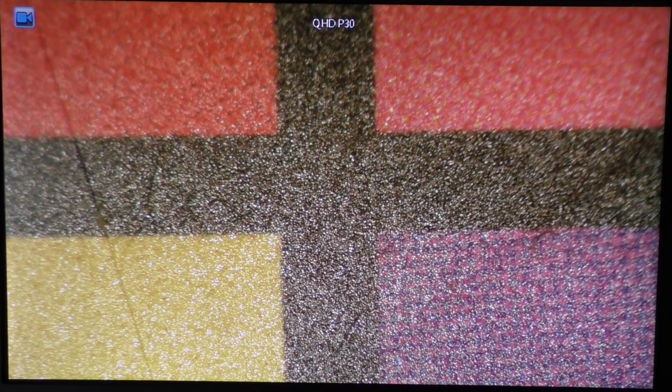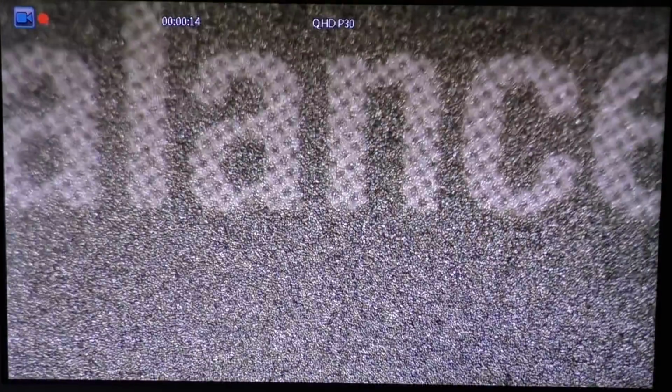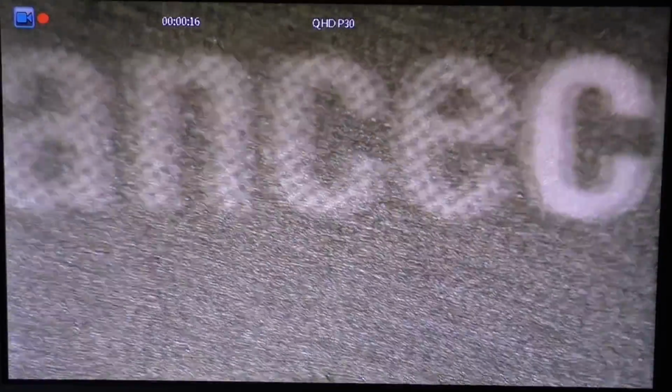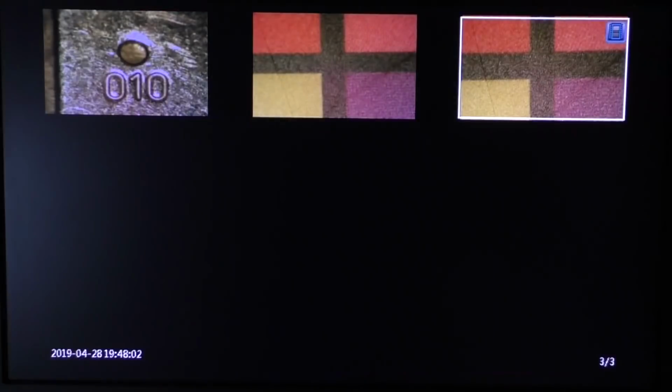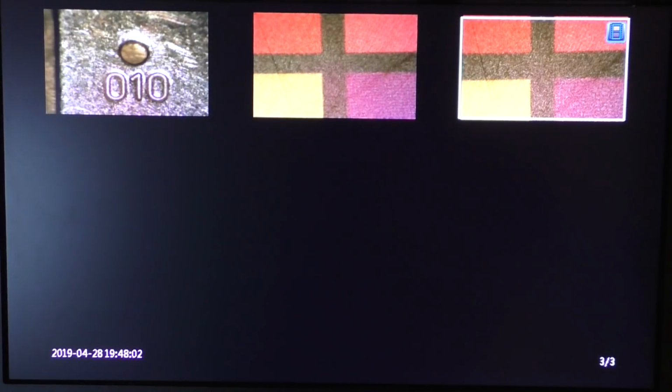And then we switch to video mode. We press the video record button and we have a counter. There is also the blue LED on the camera itself that starts blinking, and I'm recording this right now, probably. I hope so, it looks so. Let's stop that. And if I press the mode button again, we go into playback. Now we have some files to watch.